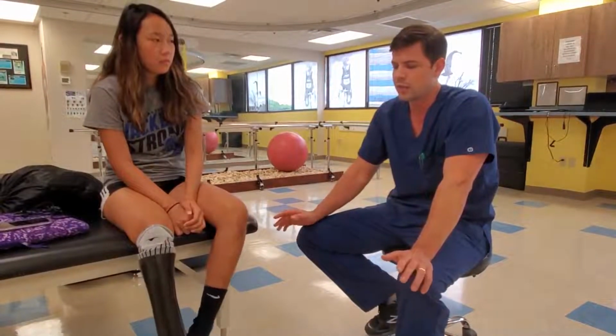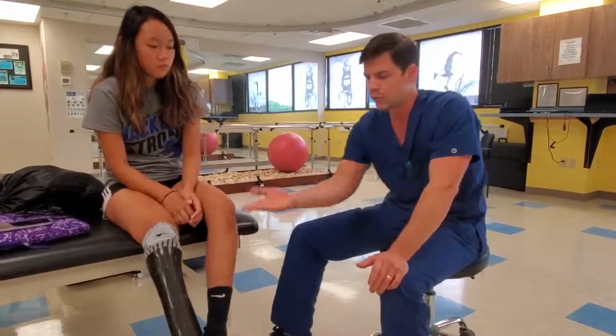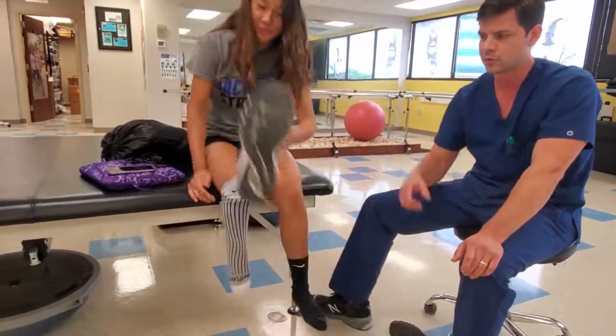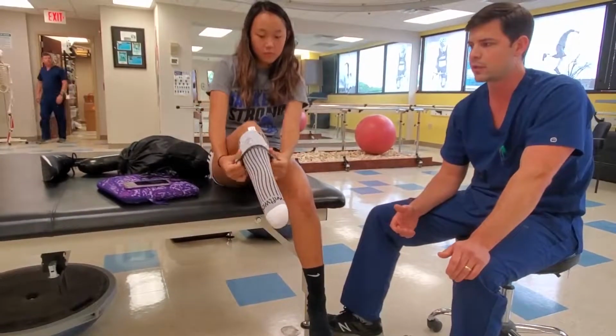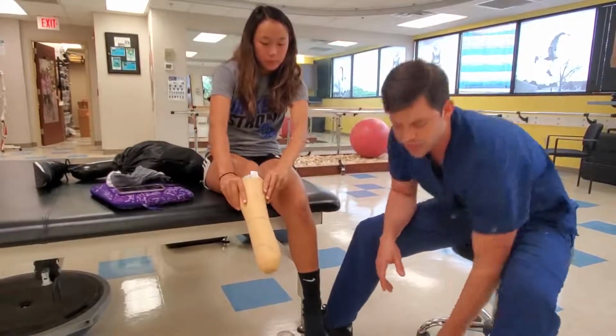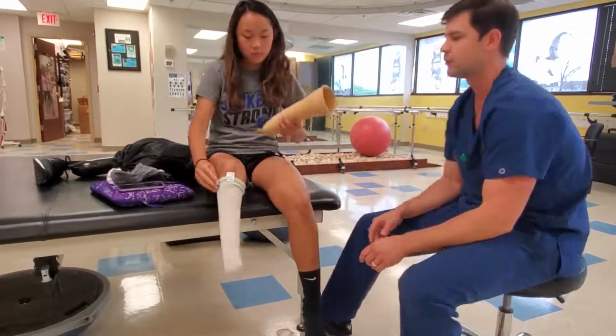And so when she got here, the first thing we did was look at her residual limb and take some measurements. And we'll just have her slip her prosthesis off quickly here. She's wearing this gray Swiftwick sock. This is kind of like a 2 to 3 ply sock. Never really measured that. And this is her P-light, very similar to what she has, a stovepipe P-light with a slit. And let's show your skin off there, Katie, please.